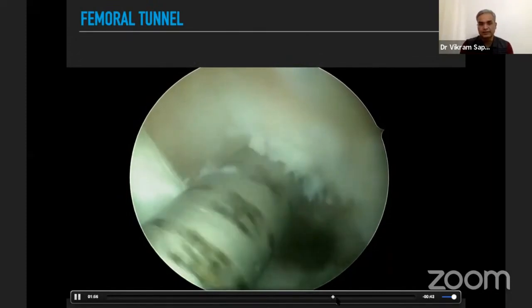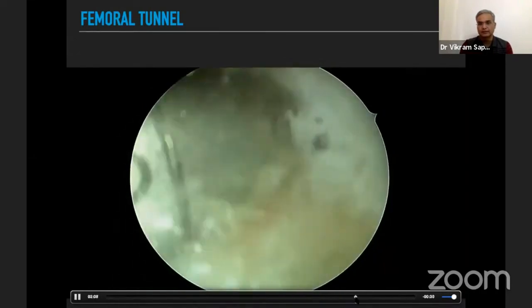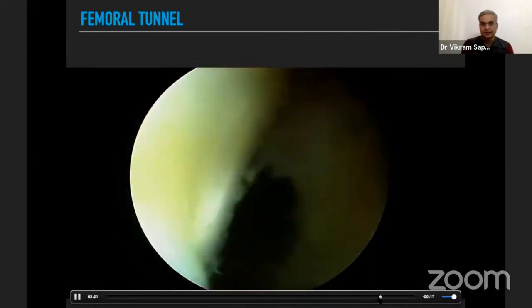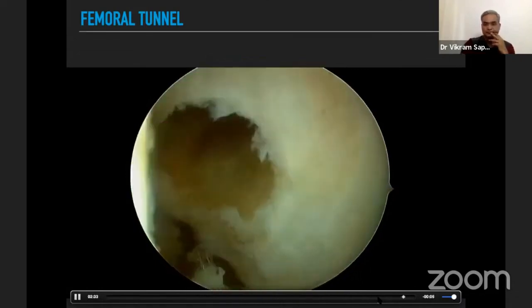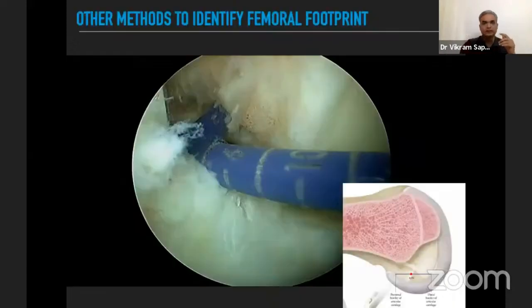Once we have drilled through the lateral cortex, a tunnel of the desired size is made and then further assessed from the accessory anteromedial portal. We confirm that 2 to 2.5 mm of posterior cortex remains intact. A systematic review by James Lubowitz found the center of the femoral footprint is approximately 43% from the posterior side when measured from anterior to posterior along the articular margin of the lateral femoral condyle.